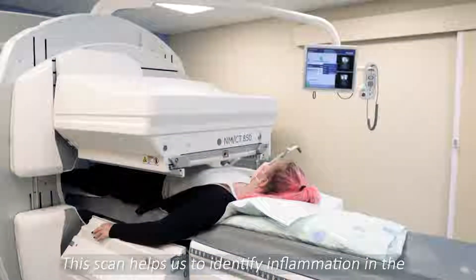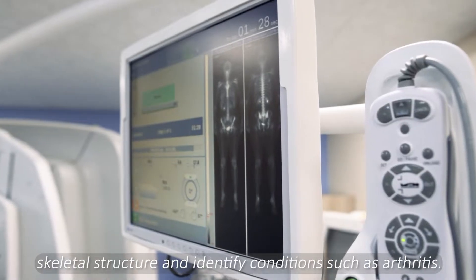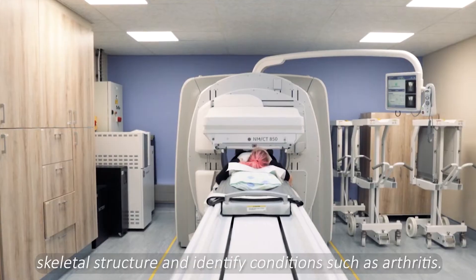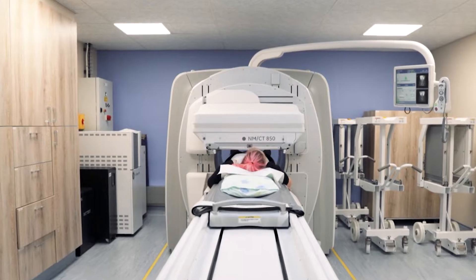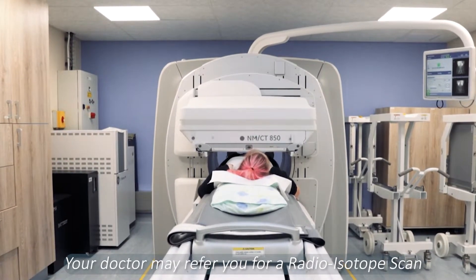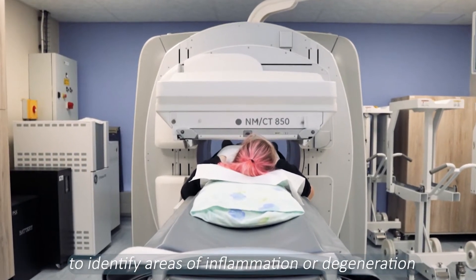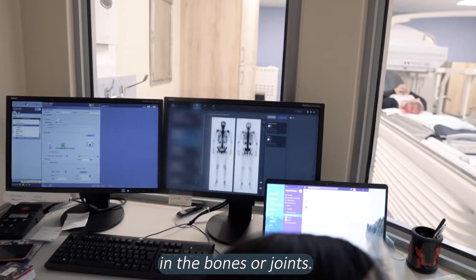This scan helps to identify inflammation in the skeletal structure and identify conditions such as arthritis. Your doctor may refer you for a radioisotope scan to identify areas of inflammation or degeneration in the bones or joints.